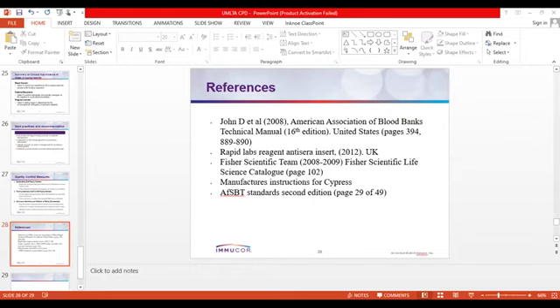Also, to emphasize to the colleagues that do the testing and confirmation, we have to be cognizant of the pre-analytical, analytical, and post-analytical factors that contribute to perhaps wrong blood groups given to these patients. I know those that are implementing quality in their labs know about this very much, but I would encourage all of us as practitioners to look into these factors: collection of samples, servicing of the equipment that we use regularly, and validating the methods that we use in our labs so that we don't get errors going forward.